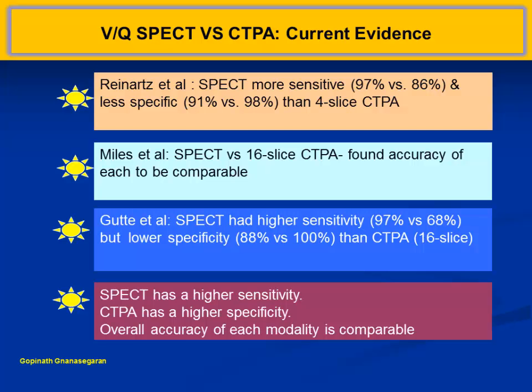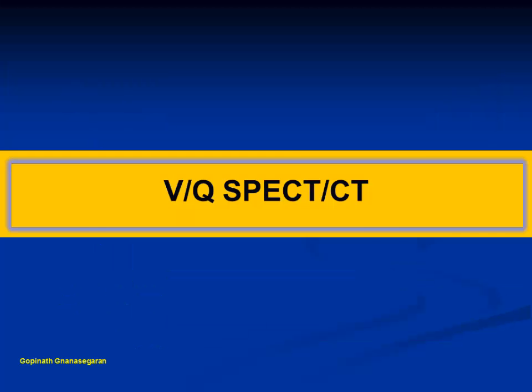Even in busy radiology departments, usually they don't want to do CTPAs, they always push it to nuclear medicine to have the VQ scan first. Whereas if you have a CT scanner in the A&E, especially at weekends, I think CTPA should be the first choice.